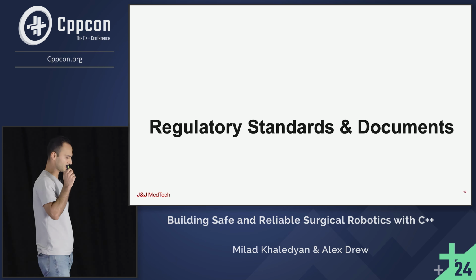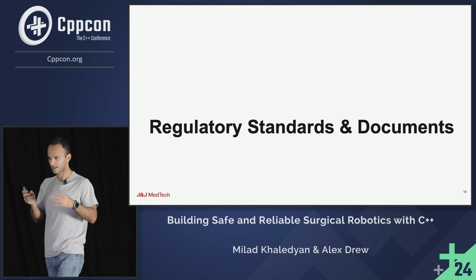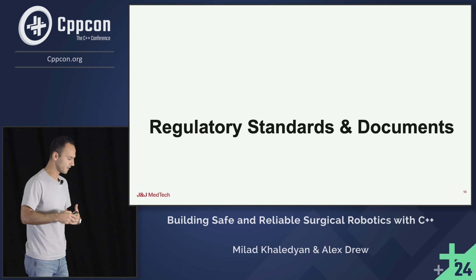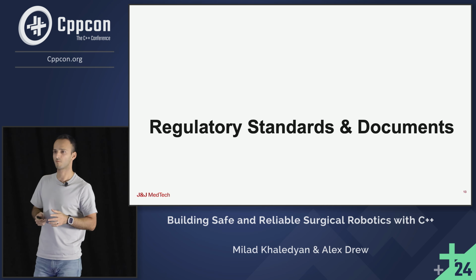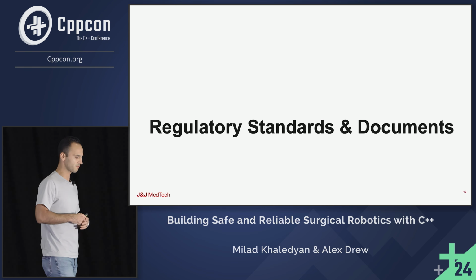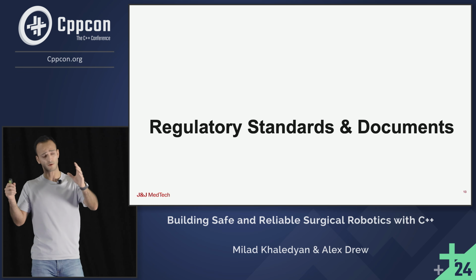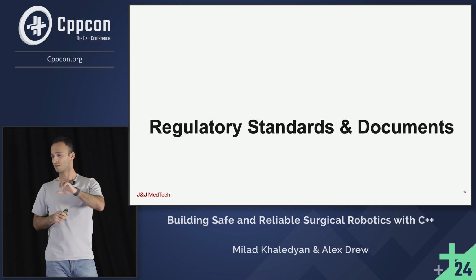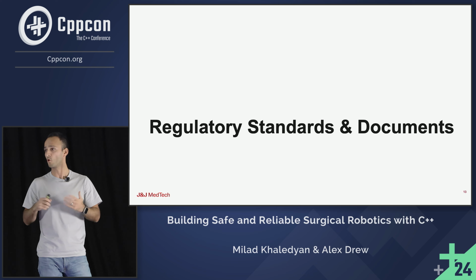So now let's shift gears and talk about some of the standards and documents we have for medical devices that at least give you some sort of guarantee of having a safe medical device. I believe it was probably the 80s, the Therac-25, you've probably heard of it. They call it the nastiest bug in software history. The Therac-25 was a radiotherapy machine with a lot of software issues in a lot of different components, but at the core there was a race condition that caused the system to fail and overdose patients with radiotherapy, and it killed dozens and injured so many people.